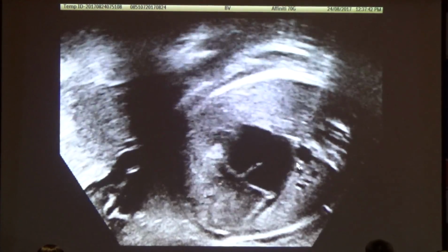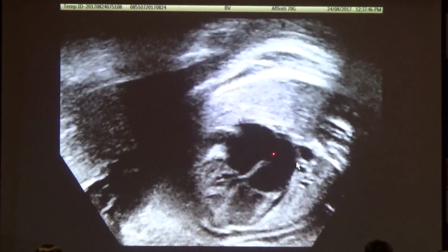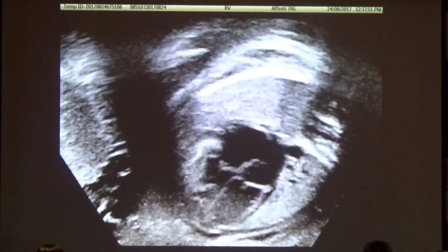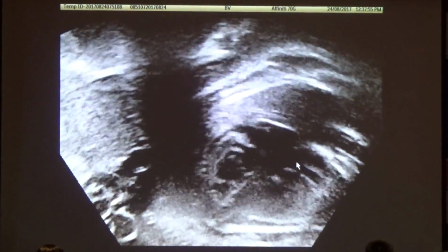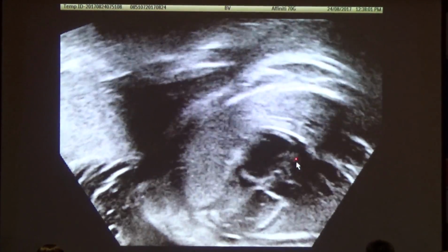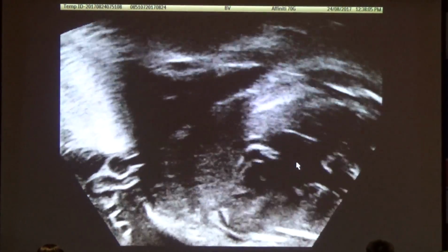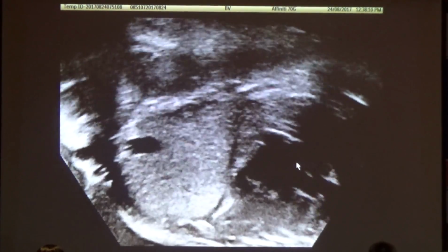Right? I'm going to try. See, there's the atrial septum. To me, it is not hypermobile. It's moving right to left with a little flip in it. So my sense of it is that this is not going to be one that's going to need an acute balloon atrial septostomy. Not need urgent. Look, I mean, everybody should be cautioned when the baby's around here. Yeah, I'm going to get another better picture here. Okay. Mom, can you turn on your side towards me?